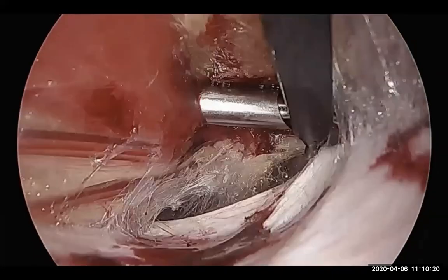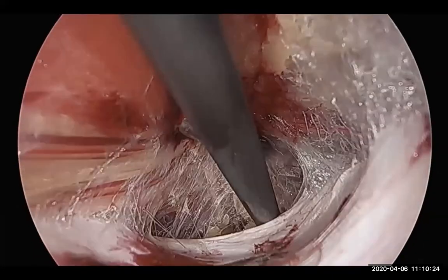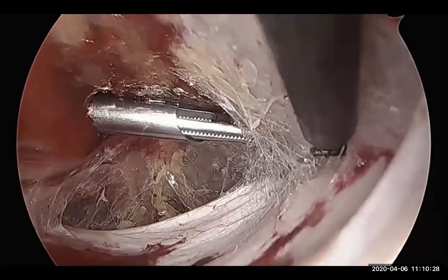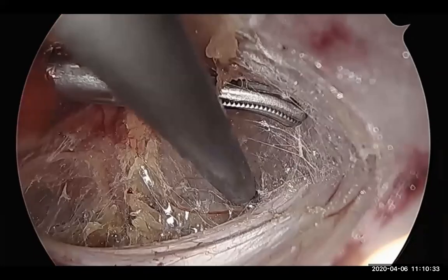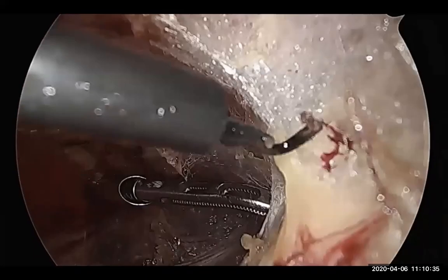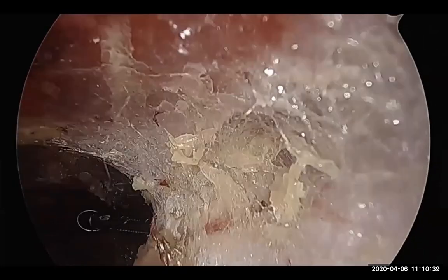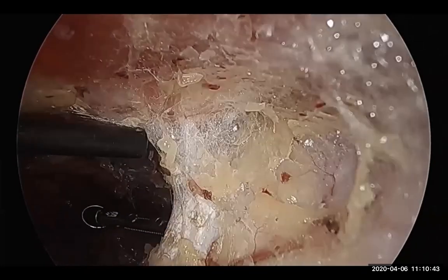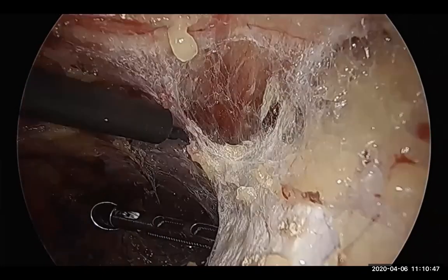I use only 5 mm ports for assistance. There's only one 12 mm, everything else is 5 mm. The hook diathermy is a very useful and elegant instrument which gives you precision while you're doing your dissection. So this is the space creation within the retrorectus tunnel. Okay, so you have 2 operating ports now and 1 camera port.